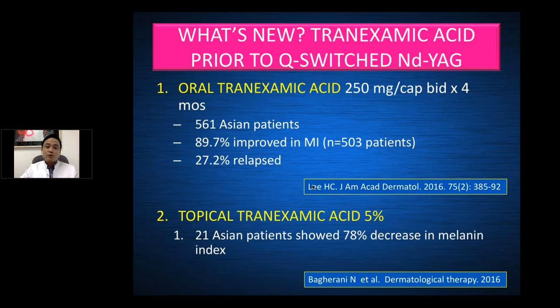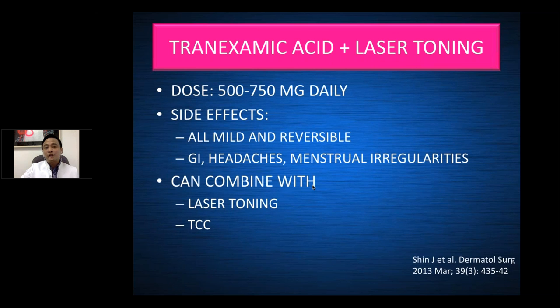So most laser experts have started prescribing tranexamic acid 2 weeks prior and 2 weeks after a Q-switch Nd:YAG session. It is usually combined with a procedure called laser toning, which I will explain later on. So these are some side effects of tranexamic acid, but in some of my patients who have taken tranexamic acid, there was no report of these side effects. So the tranexamic acid can be combined with laser toning using the Q-switch Nd:YAG and your triple combination creams.